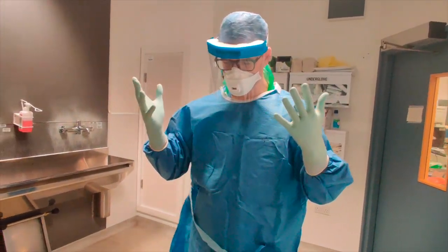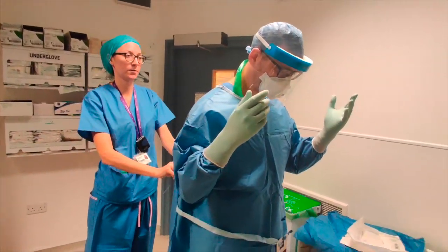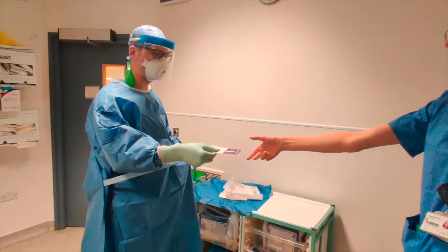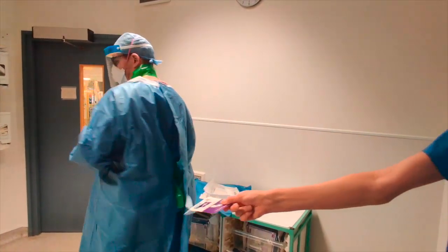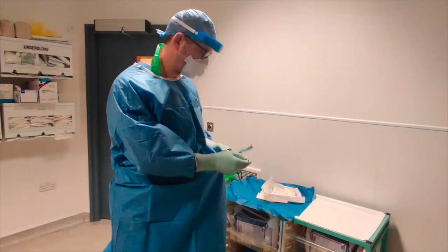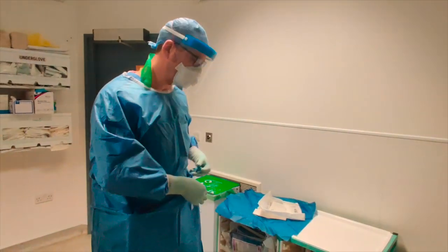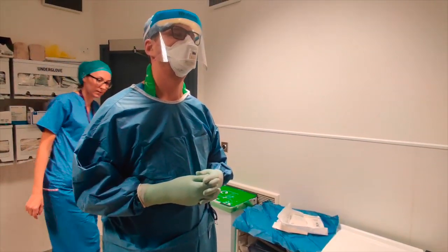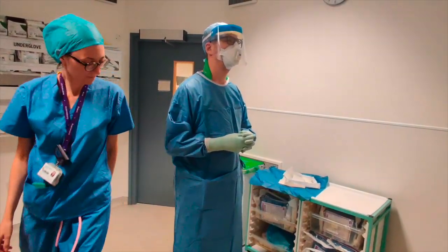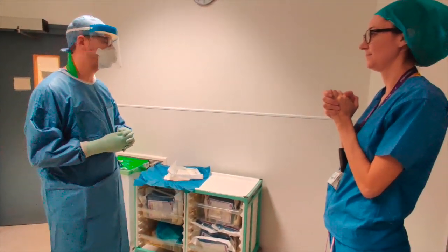I'm going to tie this very loosely so that it's not difficult to undo later. I'll check, and my buddy will check — we are happy. Let's do an operation.